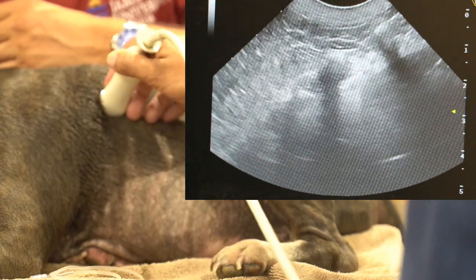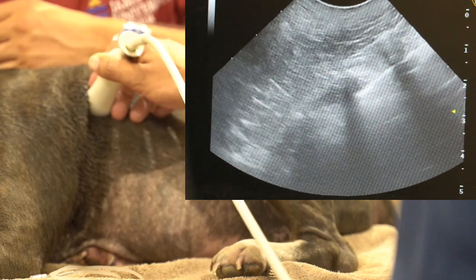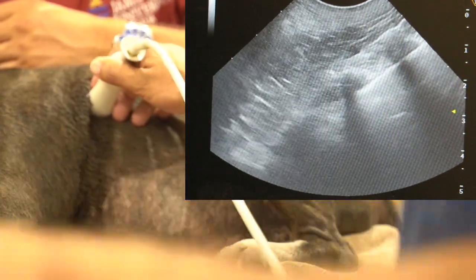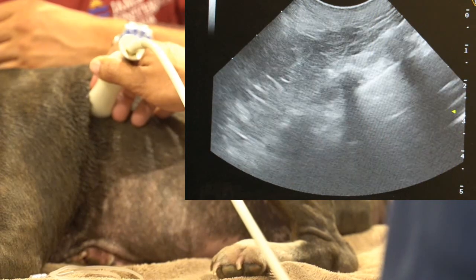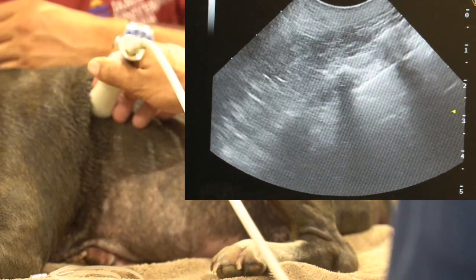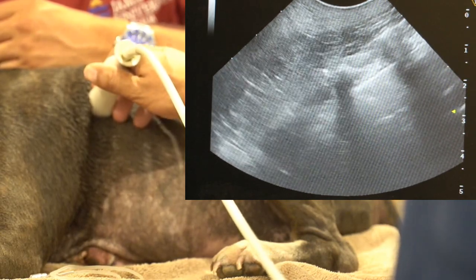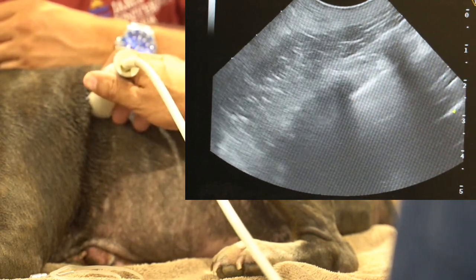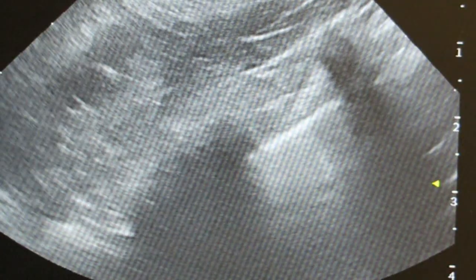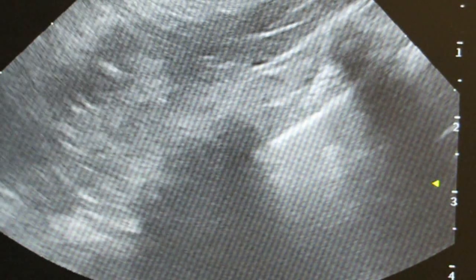Then you go across two more ribs and look for glide sign. Glide sign tells us that the lungs are adhered to the chest wall. To make things easy, we can tilt it up at an angle, which can really highlight that movement or trickle of movement.